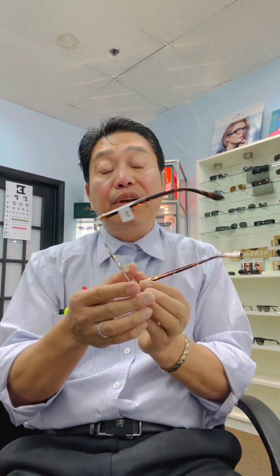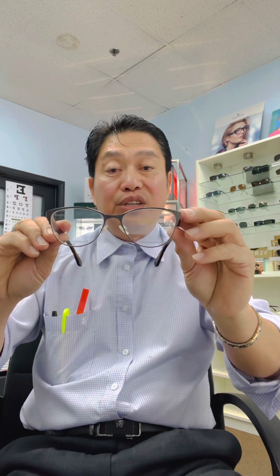Okay, metal frames also come in different colors. They come in black, they come in gold, silver, gunmetal, blue, red, you name it. They all come in different colors. Okay, so that's the first material that we use for your eyeglasses.